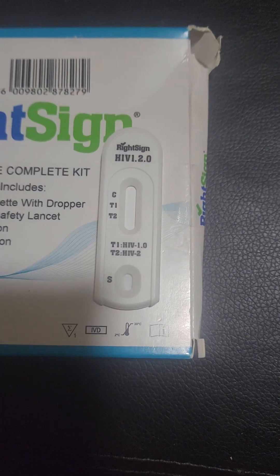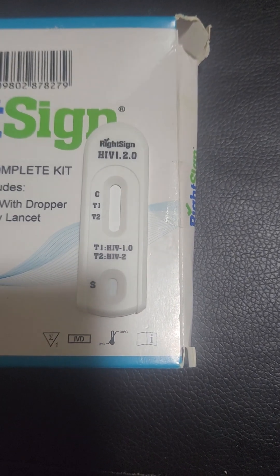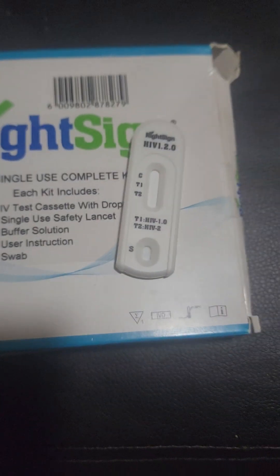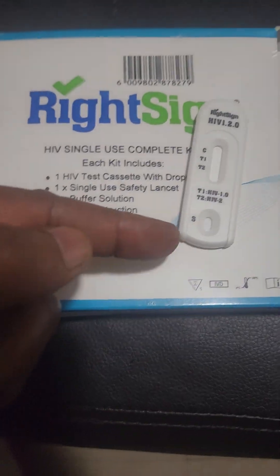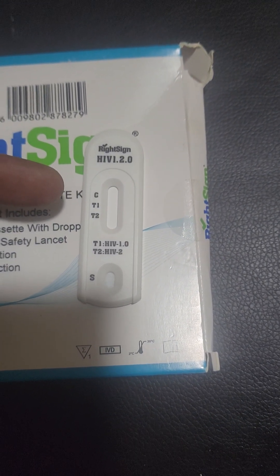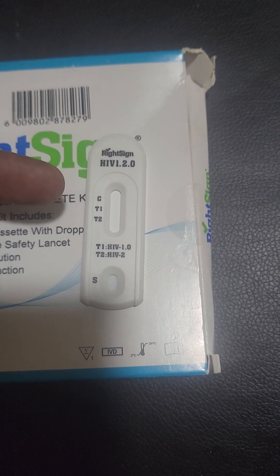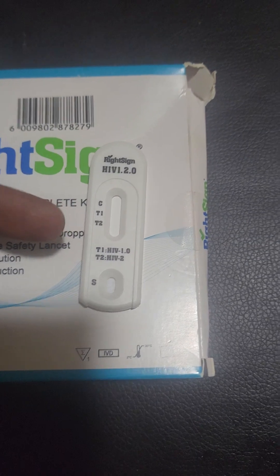The test cassette has an indication where the sample is placed under S, where you have your control line and your test lines for T1 and T2, which represent HIV 1 and HIV 2.